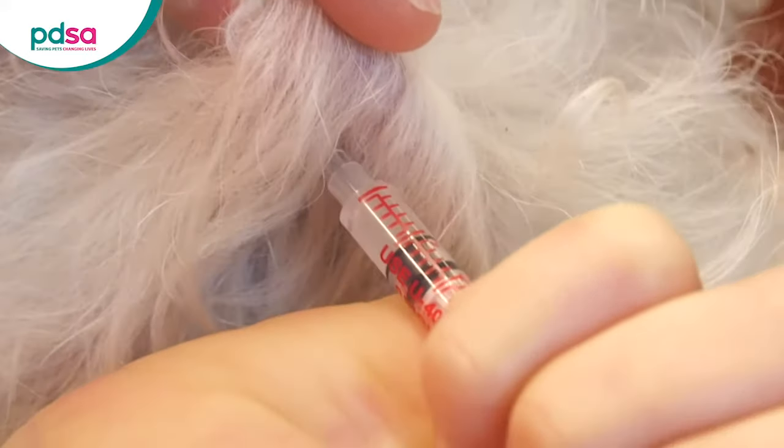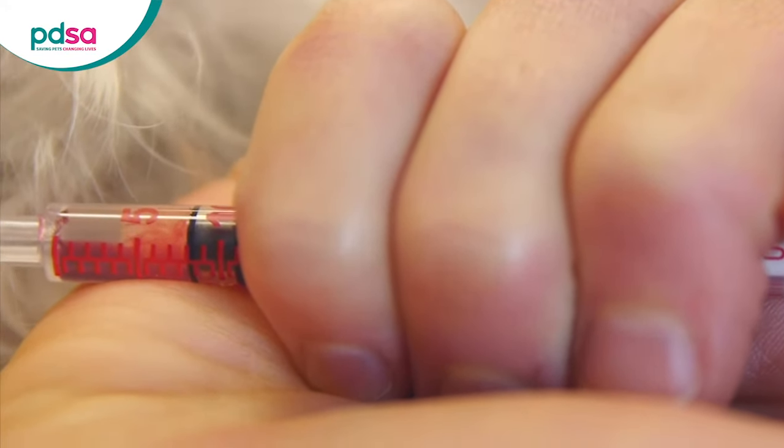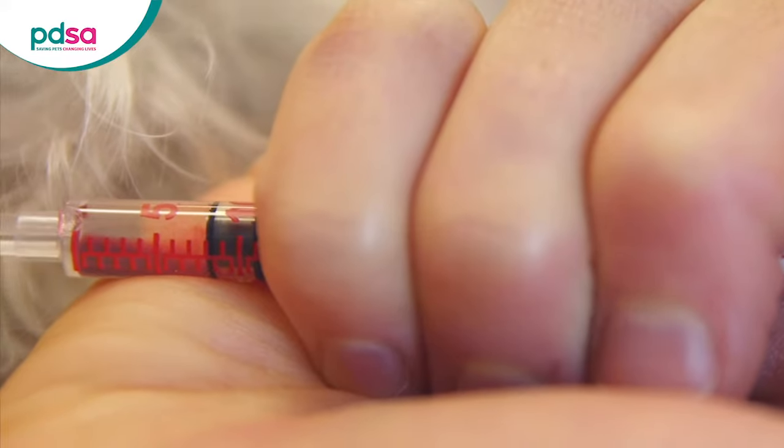Draw back the plunger before you inject. This may take some practice as holding the syringe properly may feel strange at first. If you see blood in the syringe when you've drawn back, don't worry but don't push the plunger.